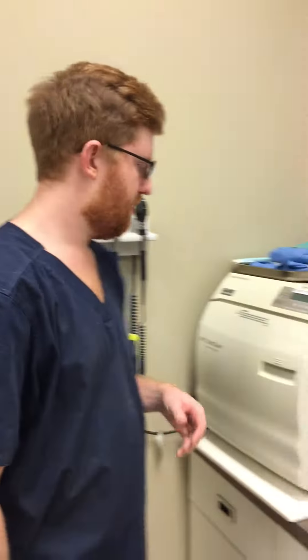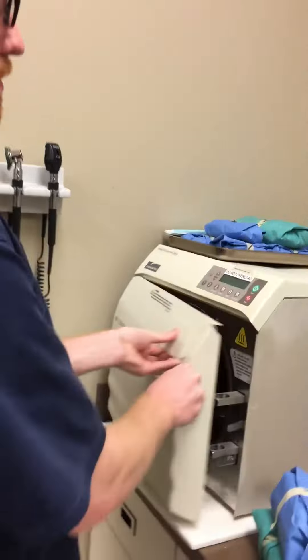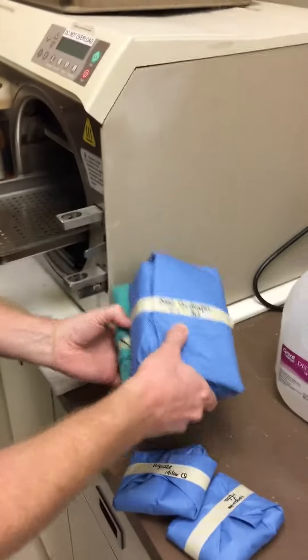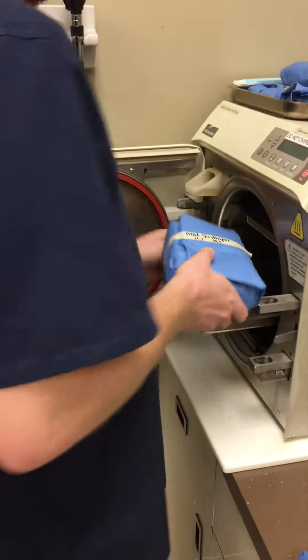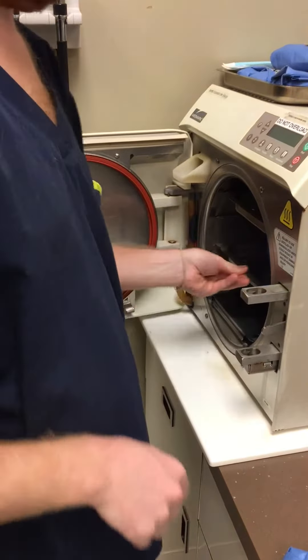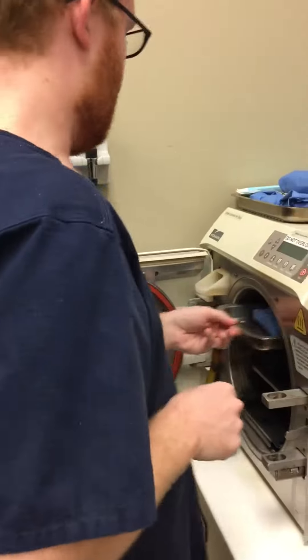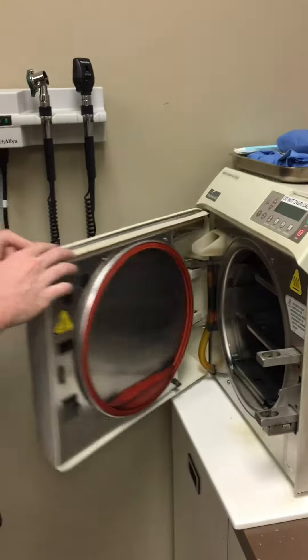I'm David Mullinax and I'm going to be showing you how to operate and maintain an autoclave machine today. First thing we're going to do is set it up and fit our packs loosely into the machine. We don't want them snug at all — we want them all to have room to breathe. So we put them in here and shut the door like so.